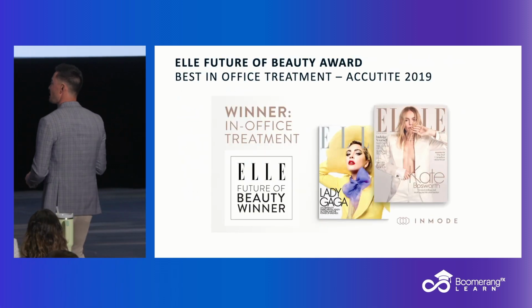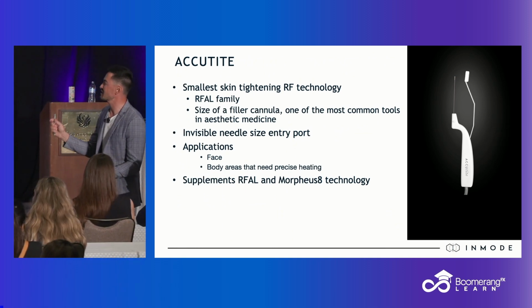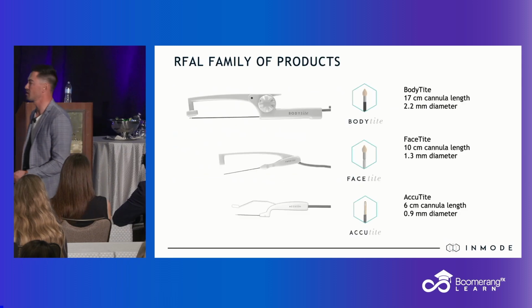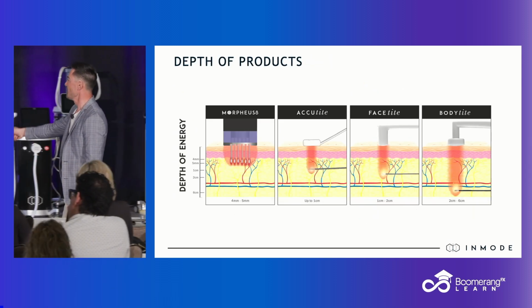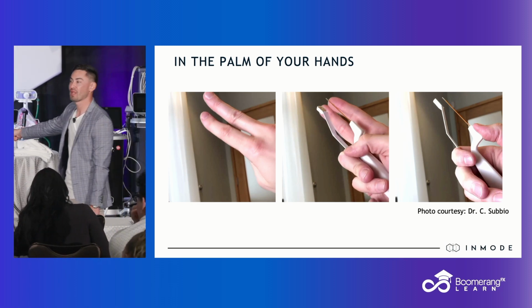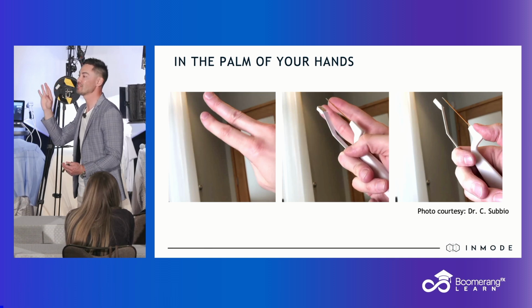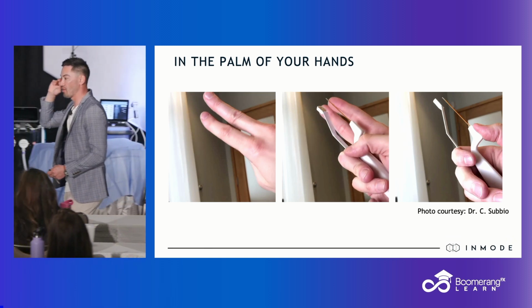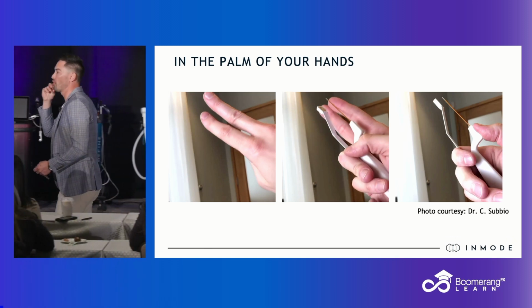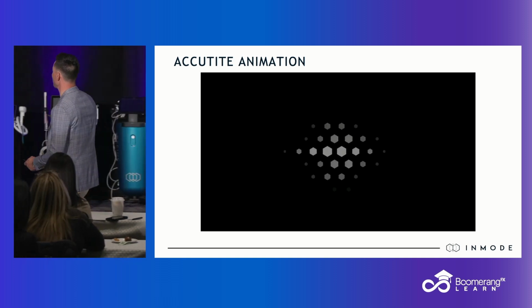So it's a 22 gauge cannula. The size of a 22 gauge cannula. It's the same exact science. So I'm going to blast this as everything else we've talked about, bipolar radio frequency. And I couple it with Morpheus. This is the size. Look how tiny this is. And I can apply this with a tiny little 18 gauge stab anywhere in the face. Inconsequential. So if I want to do lateral brow, under eye, nasolabial fold, jowl, submental, just a little stab, and then I treat to endpoint temperature.